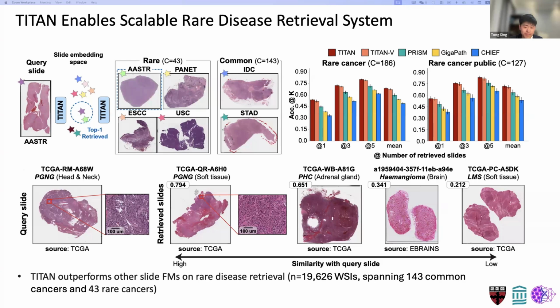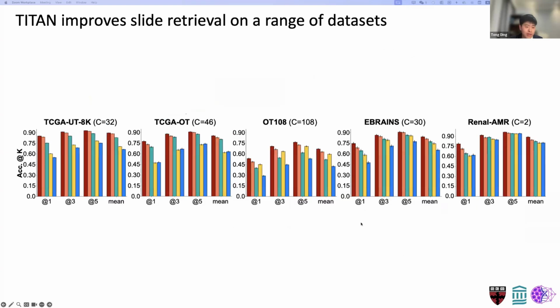And further to that, we also benchmark more commonly used datasets using these retrieval systems, and Titan still demonstrates favorable performance as compared to other models.